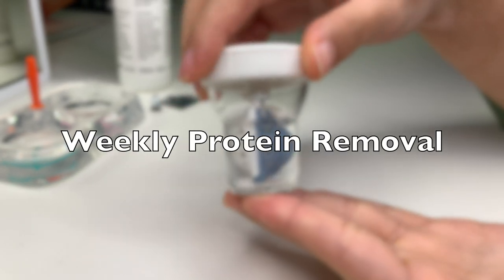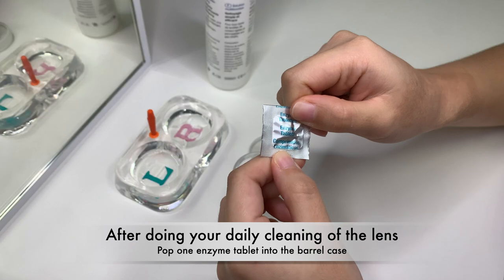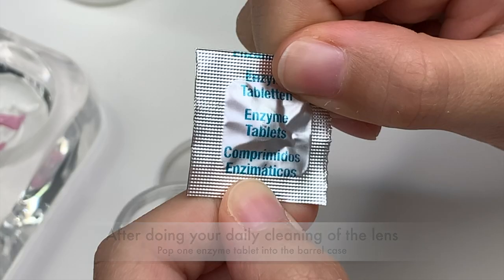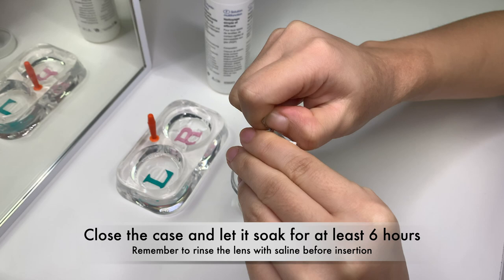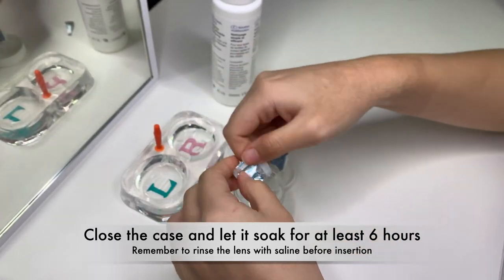Once a week, remember to do protein removal. After your daily cleaning of the lens, pop one enzyme tablet into the barrel case. Once the tablet is in the case, close it and let it soak for at least 6 hours. Remember to rinse the lens with saline before insertion.